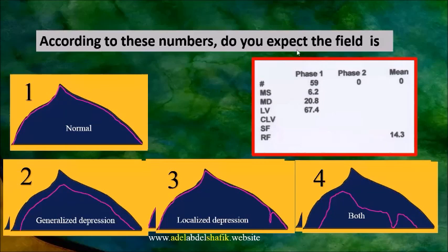Actually, I don't have these numbers in my mind, but I depend on the sign given to me by the probability next to the number. So if I'm not sure, I just ignore this part and go directly to the pattern deviation, total deviation. So this is my answer. I don't have a limit number to tell you to use.